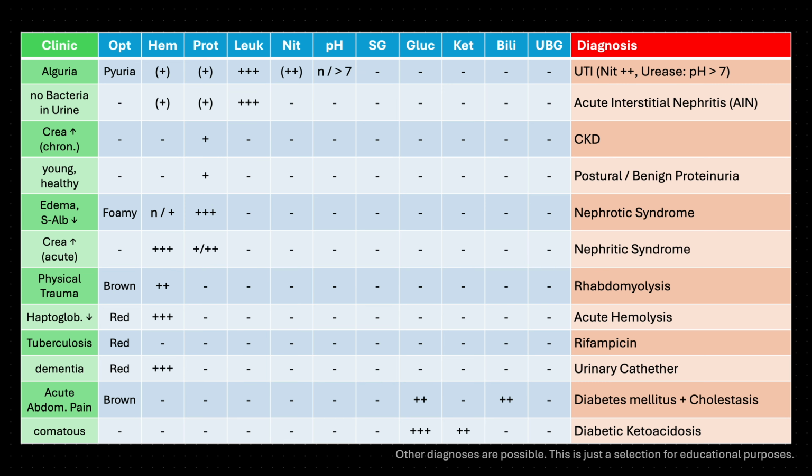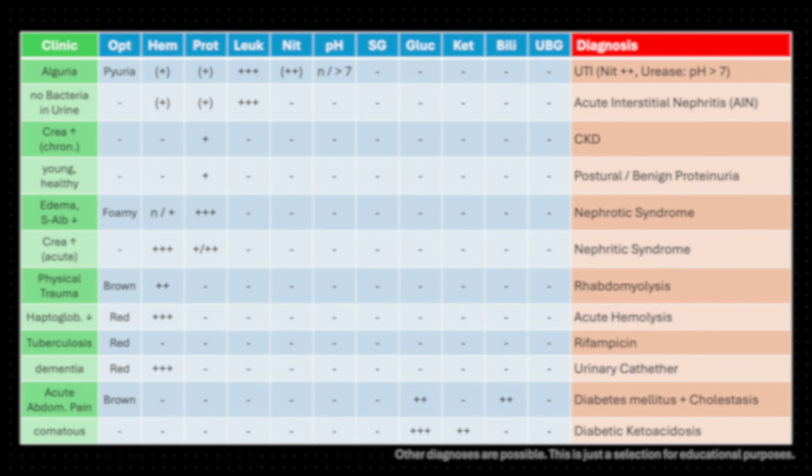And remember that these are just imaginary and exemplary cases. Don't forget to think about multiple diagnoses at the same time. It's more common than a rare disease which fits all criteria.